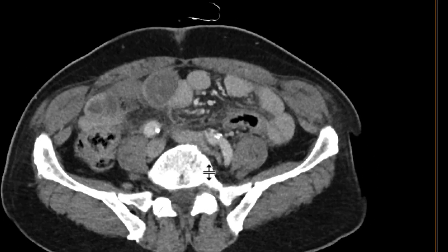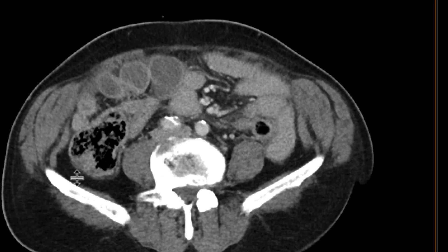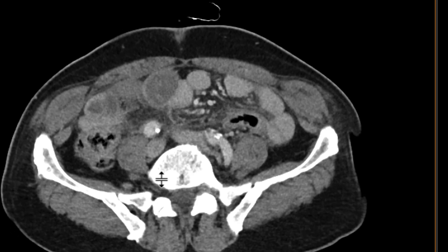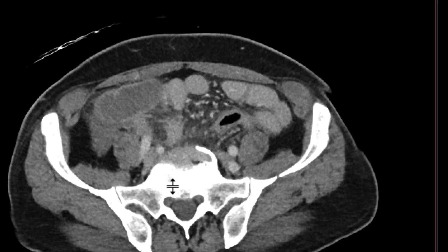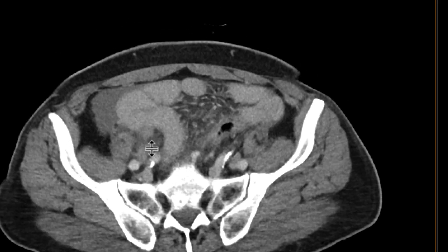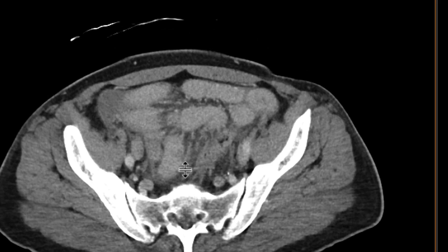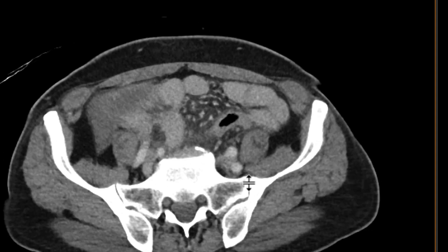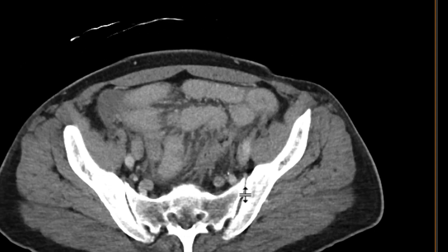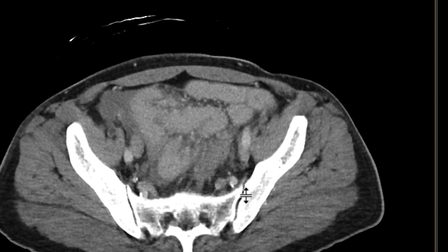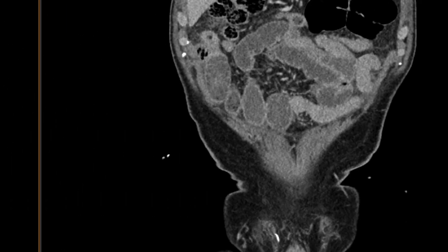We then examine that a little bit more closely. We can see the cecum filled with stool and a little bit of gas. We can see a structure coming off the cecum — thick-walled, going all the way down and blind-ending. So it's a thick-walled, tubular, blind-ending structure, and it looks like there's a little bit of stranding adjacent to it.